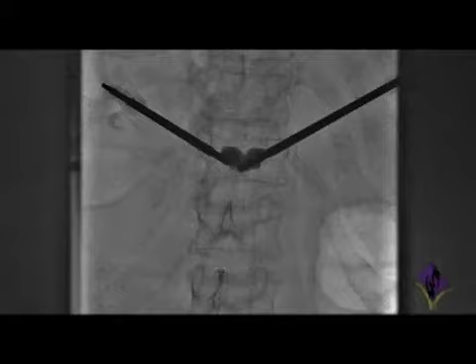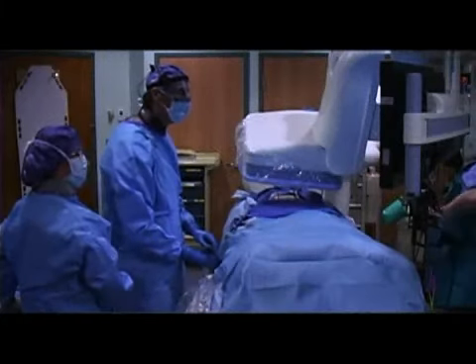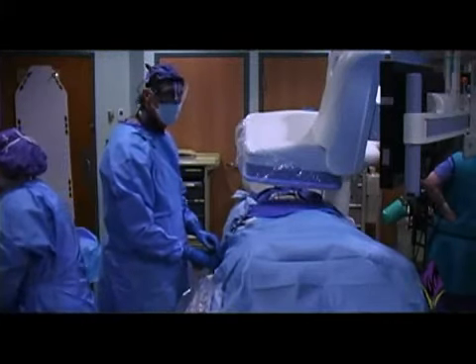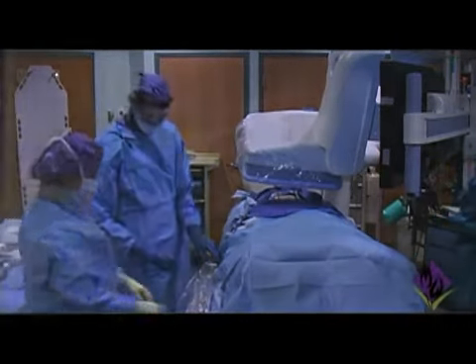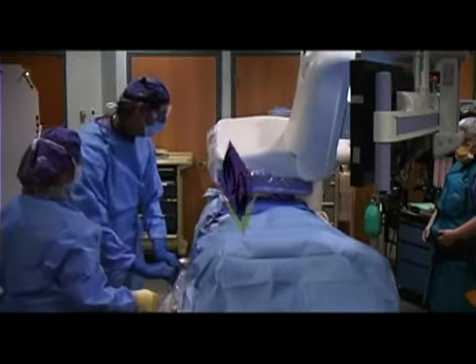So there's very good filling of the vertebral body just along the undersurface of the superior end plate, which is where the major component of the fracture is. And now that's well supported. So I think we're all set. Let's take a look at the lateral view for a final film. And again, on the lateral view, there's very good filling centrally as well as supporting the undersurface of the superior end plate. Okay. Thank you, everybody. We're all set.